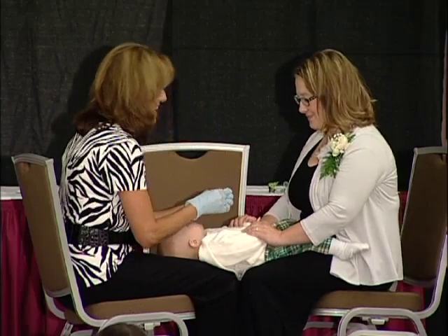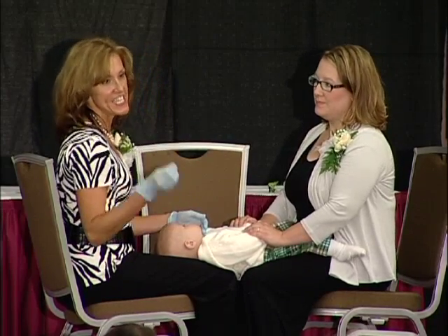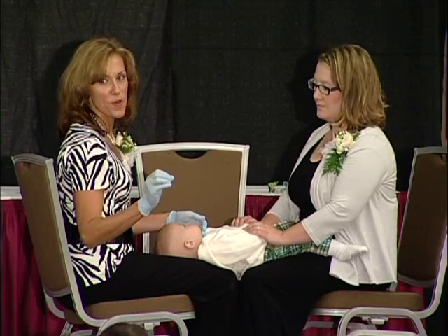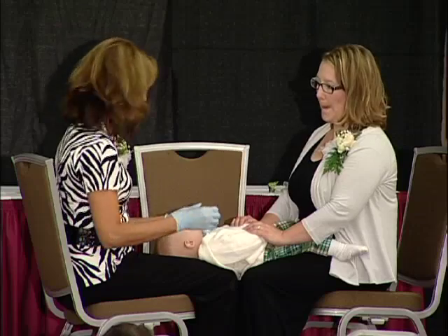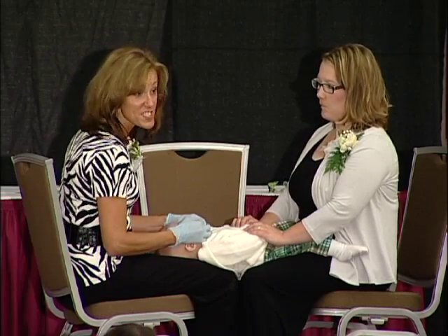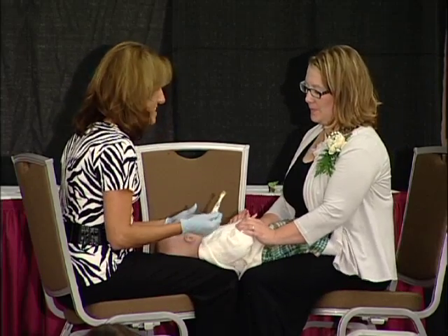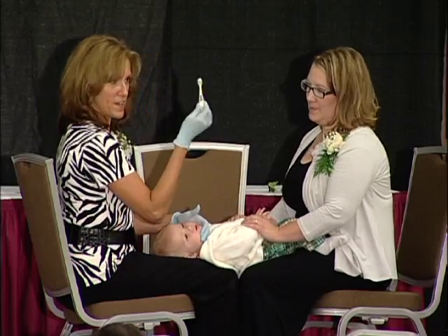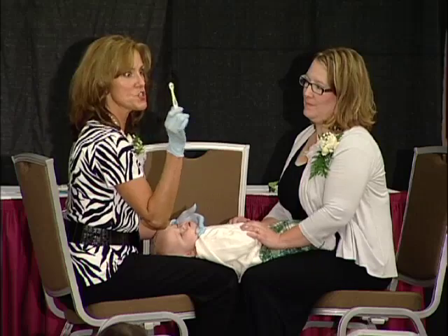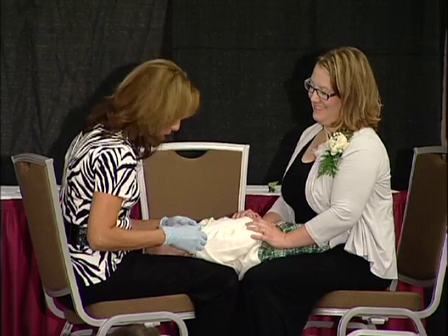Cool. Now, one of the very first, easiest tools for you to use is the infant toothbrush. I can tell so much by just having that brush in there for just a couple of minutes. What I'm going to be looking for is plaque, the amount of plaque, any inflammation when I get that toothbrush in there. And I start with our stage 1 toothbrush, fantastic for those under age 1 and just shortly above.